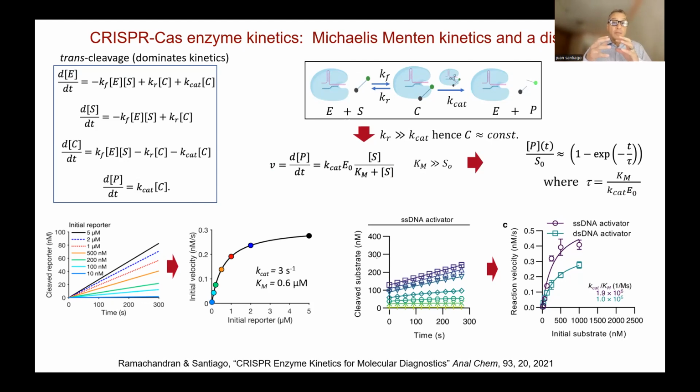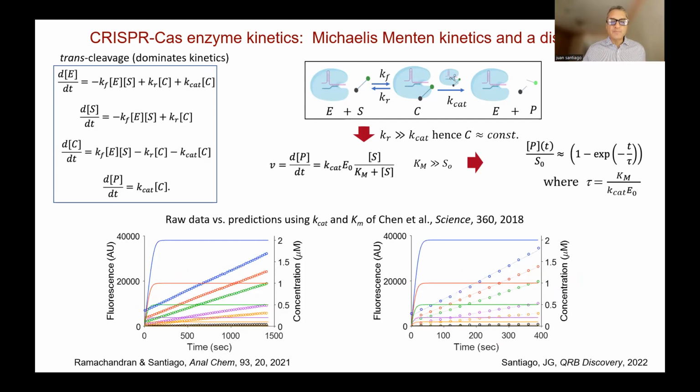They're determined and governed by a wide range of parameters, including the sequence of the guide RNA, the target sequence, the concentration of the various reagents in the buffer, pH, and temperature as examples. But for a given temperature, for example, and for fixed chemistries, you expect some fairly repeatable kinetic rates.